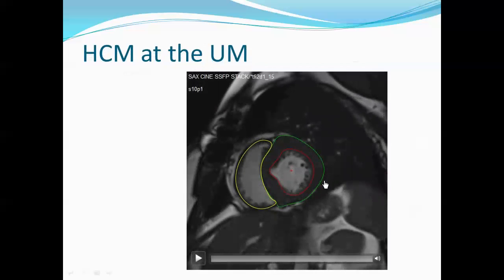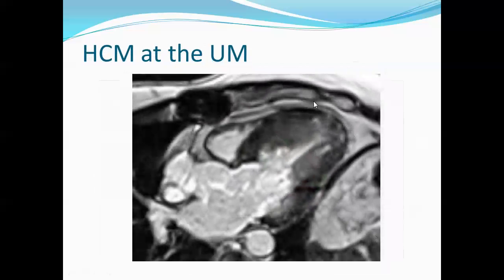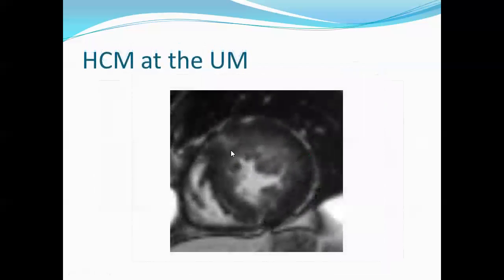So every time we do an HCM patient, we do have to do LV mass, even though it's not necessarily part of the diagnosis. This just shows the hyperenhanced areas in the walls that are thickest. And again, here, it's probably thickest up here, and so this is where all the late enhancement is. And that's pretty much it. So, like I said, I just wanted to hammer home why you use MRI and where it can actually add benefit in your patients when you're seeing them in clinic, when you'd refer them to us.